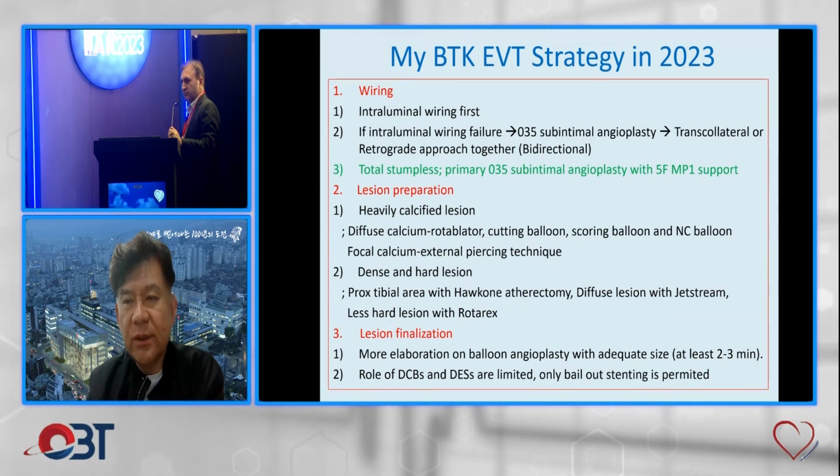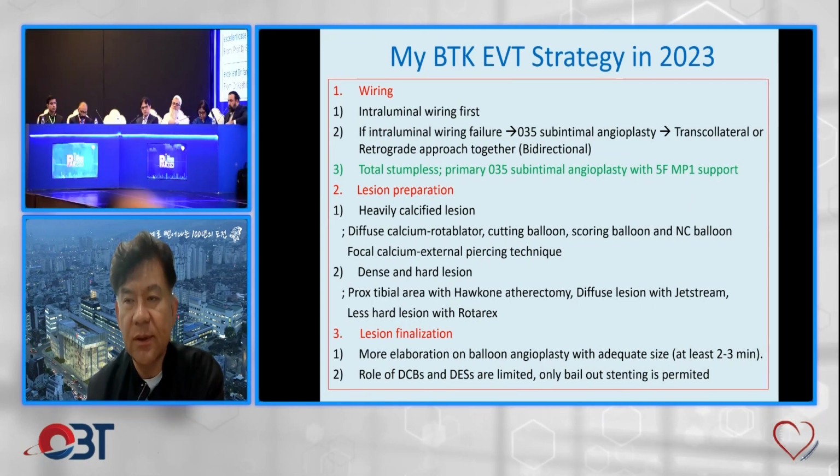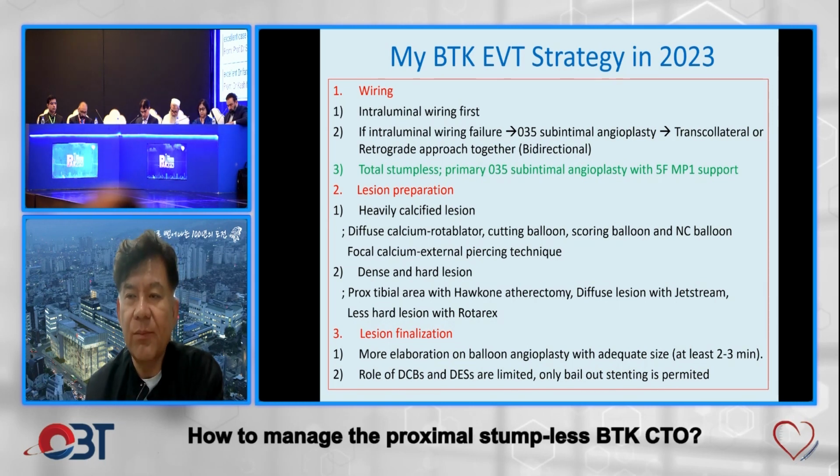Just entry point and exit point recovery completely, and the salvage of the limb is most important. In our data, it's no problem either by the subintimal or the intraluminal route, despite the risk. We are now conducting a randomized study of subintimal versus intraluminal, but until now we don't have any difference. So I think limb salvage is the most important issue.